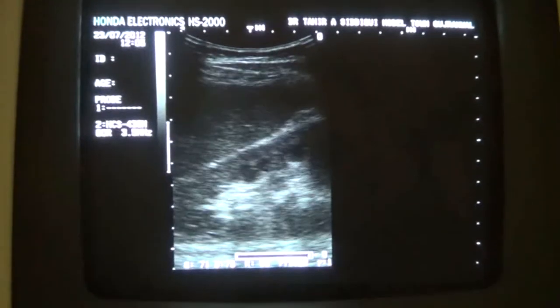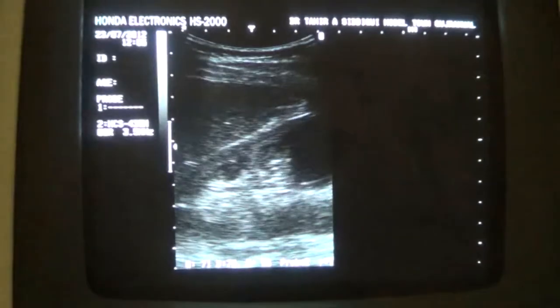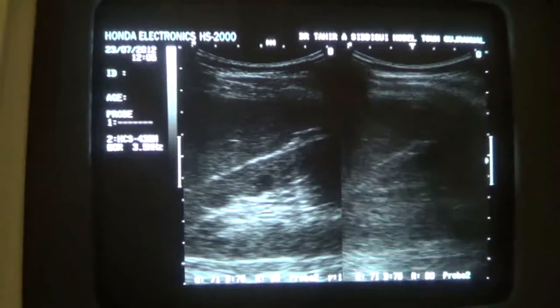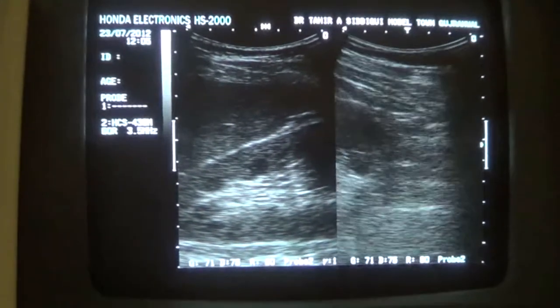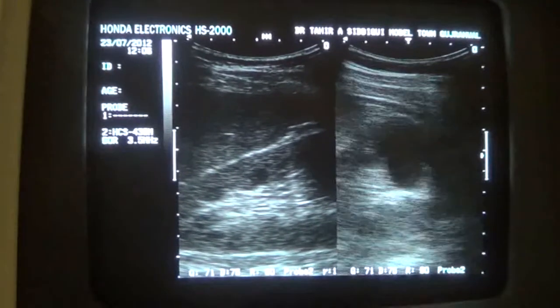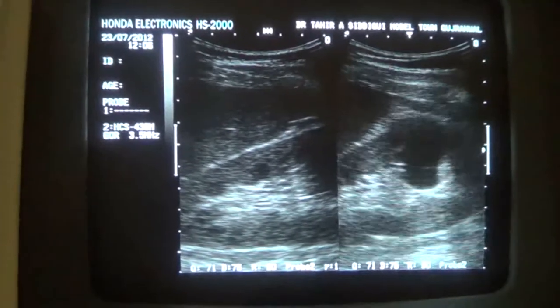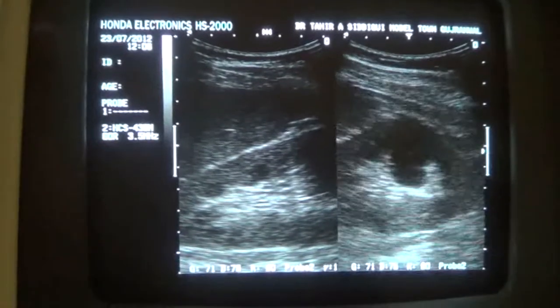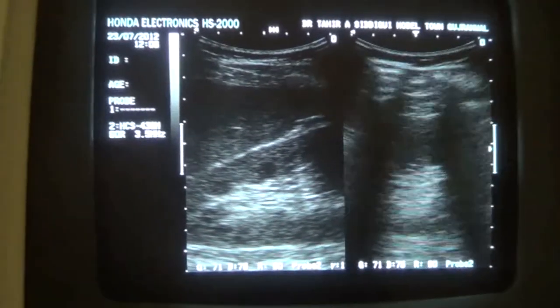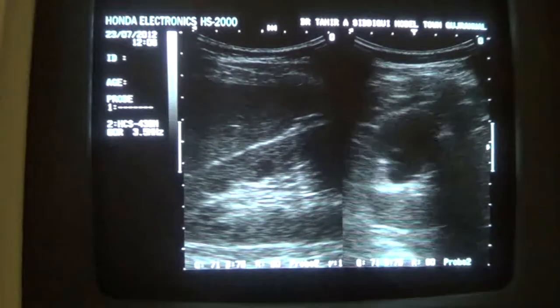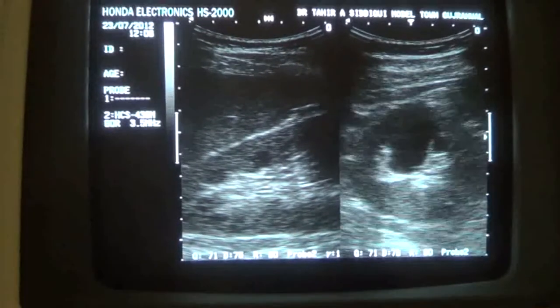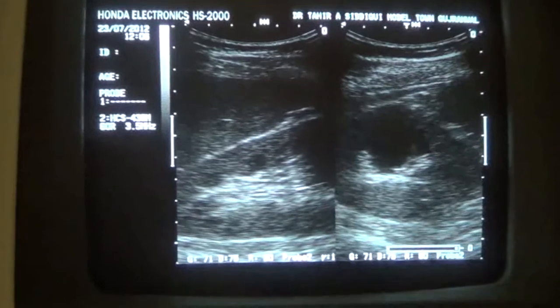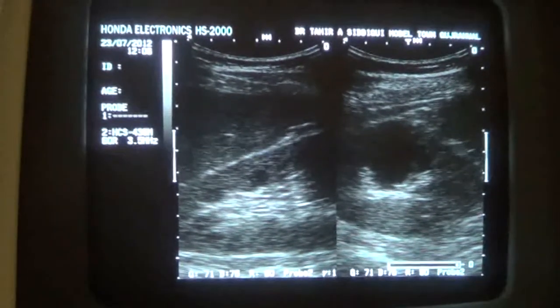Don't confuse a renal cyst with prominent pyramids. If these are the pyramids, then this is the cyst. You can see the location of the cyst — it does not change its position or shape when I move the probe across the section. You can see that the shape remains the same.